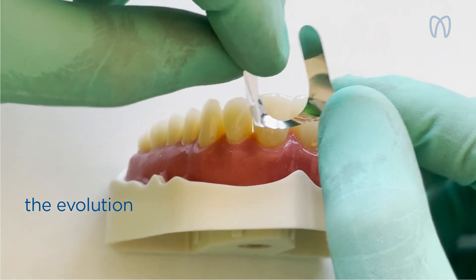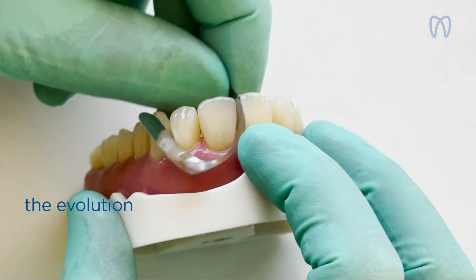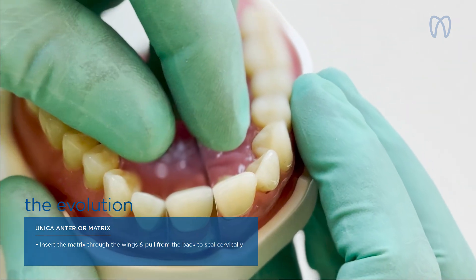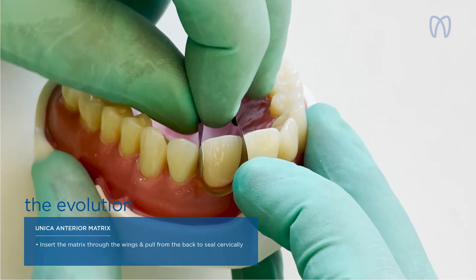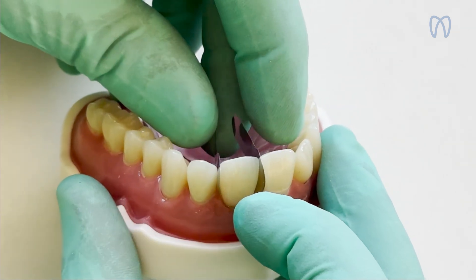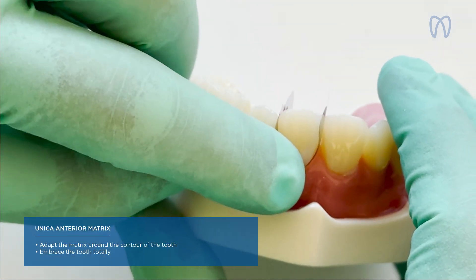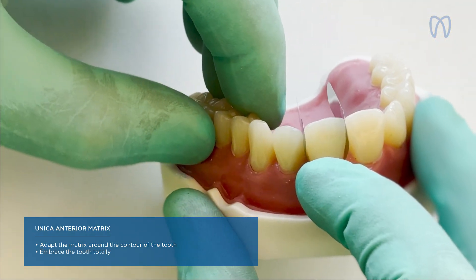The UNICA matrix was really the right evolution to do things properly. The idea was to insert the matrix and — as you can see — it has two wings that give you the chance to pull the matrix, to re-adapt it around the contour of the teeth and embrace the tooth totally. By pulling, pushing, or blocking the matrix with some flowable composite, it is possible to have all the contour of the tooth.